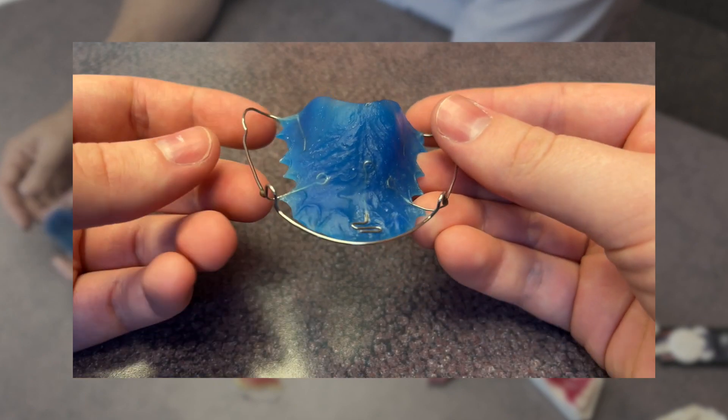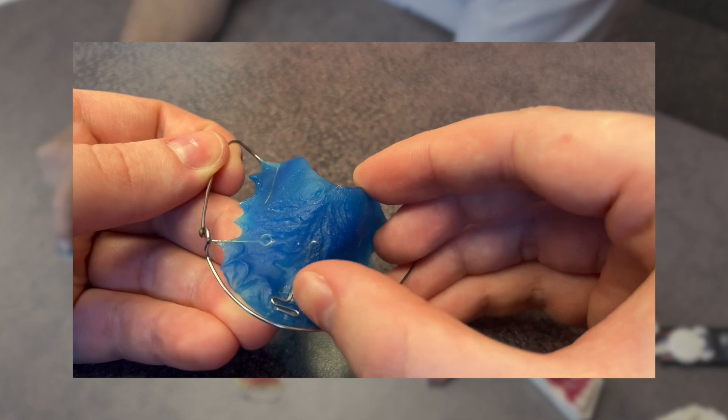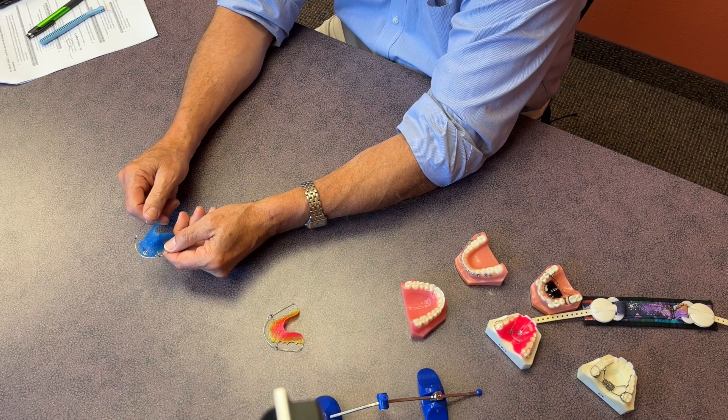Other removable appliances can be as simple as a traditional Hawley retainer. This Hawley retainer happens to have a spring embedded to help change the position of a specific tooth. That recurve spring is adjusted to provide tension or pressure to help move a tooth without displacing it from resting in the teeth.